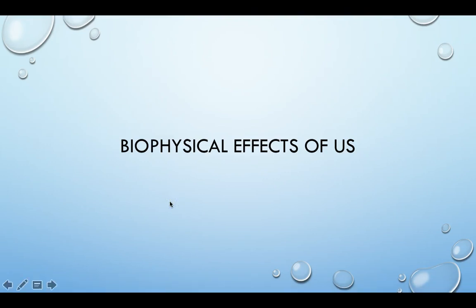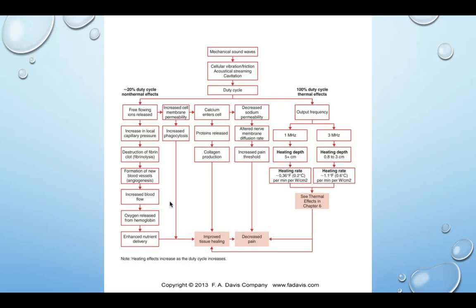Okay, so now that we know some of the terms behind ultrasound, let's talk about what those effects are. What are the things that we would use ultrasound for and why, okay? So this is the chart from your book that again kind of breaks down. So we're producing those mechanical sound waves.